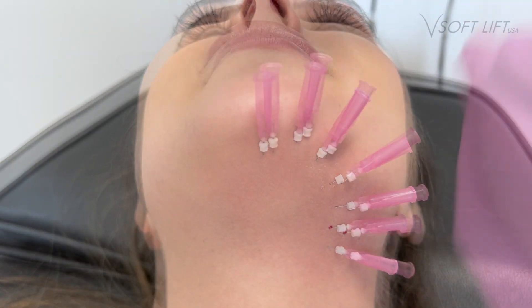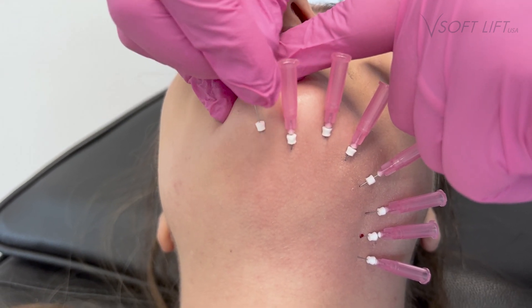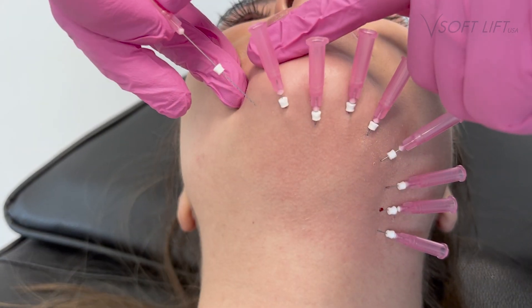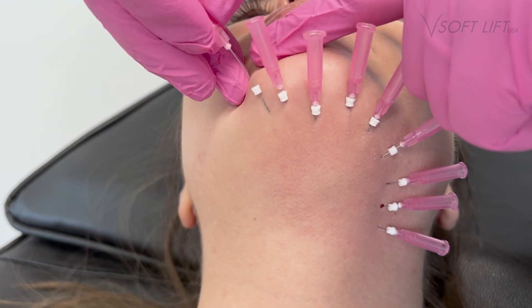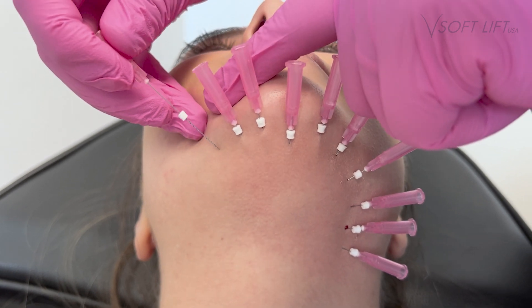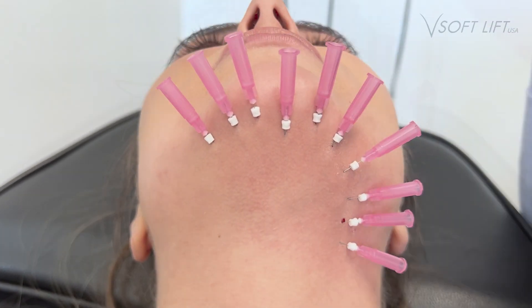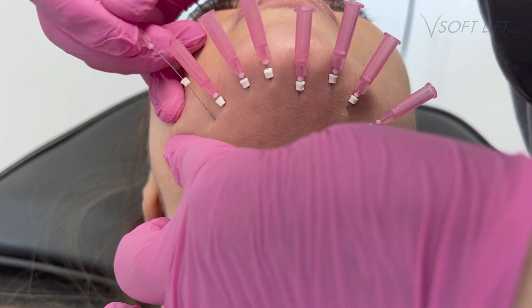The reason I've chosen twisted threads — you can see as I'm about to enter the tissue — the thread is actually wrapped around the needle. Because of that, it creates more tissue injury upon insertion, and therefore is going to stimulate even more collagen and elastin than you might receive with a monothread.